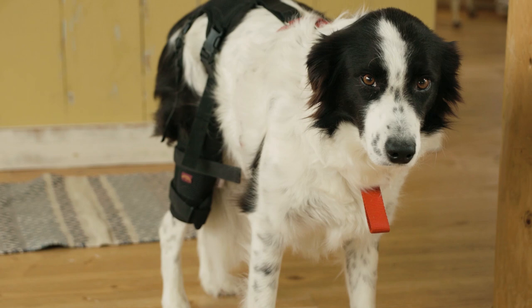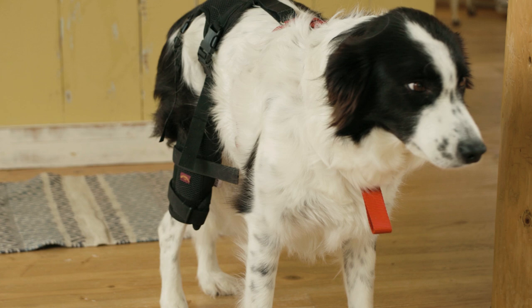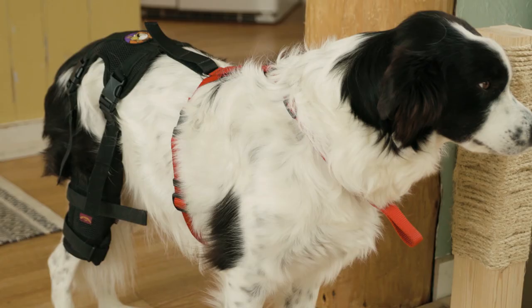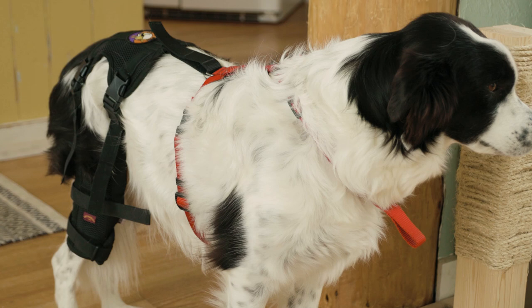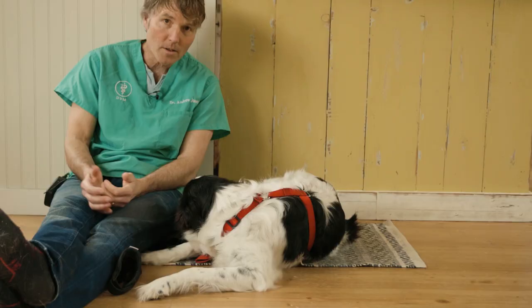Heather actually has the Ortho Dog anterior cruciate ligament knee brace. I'm going to show you what it is, how easy it is to put on your dog, how to size your dog, and whether it's an option to help your dog heal naturally at home.